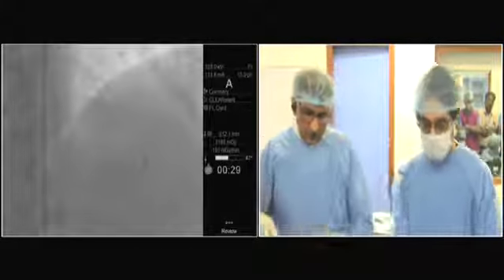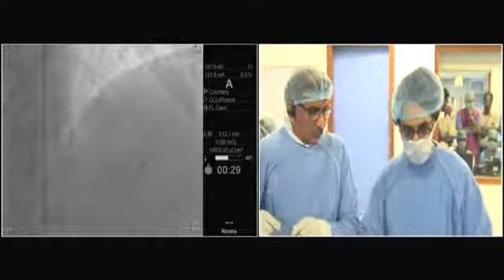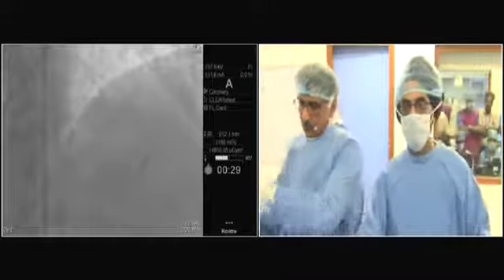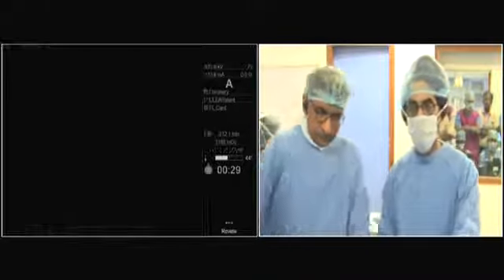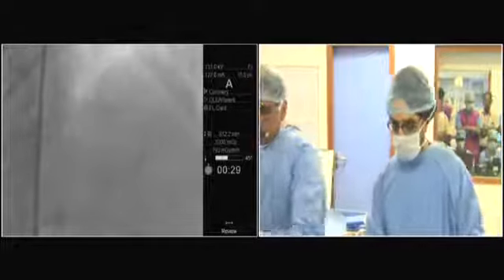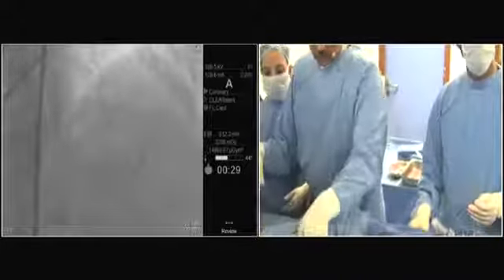Okay. 2.5. It's an important picture because when you are not doing the DK crush, sometimes when you crush the side branch stent with the main vessel stent, you are pushing the stent away from the carina. And then if you re-enter the side branch, you can re-enter outside the stent in the side branch. Beautiful pictures have been shown in the past by Yoshinobu Murasato here. I remember the case. But here we see clearly that you are inside the stent. So the question you have is to try to cross proximally, but not distally, not close to the carina.